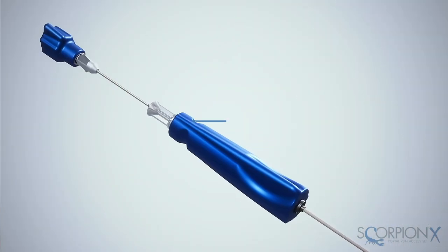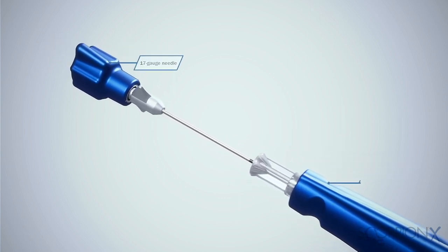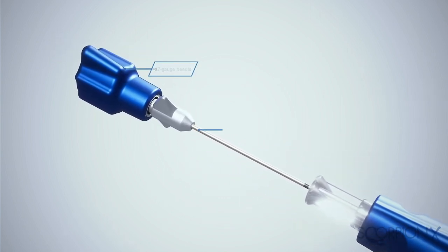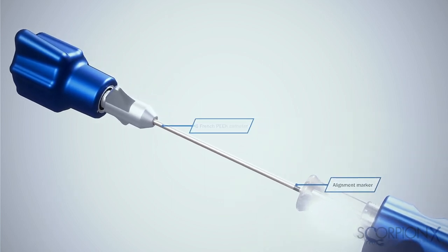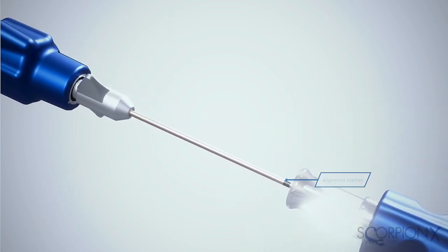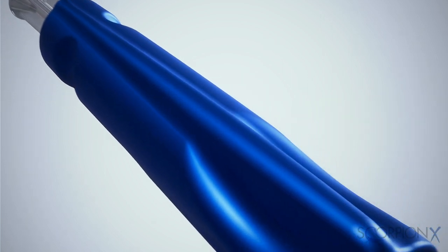You'll now use the ScorpionX's 13 gauge stiffening cannula and 17 gauge needle, complete with an echogenic tip, and its durable 6 French peak catheter. Both the needle and stiffening cannula include a unique black alignment marker that acts as a visual aid to indicate internal tip positioning.